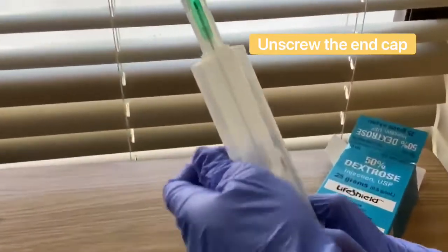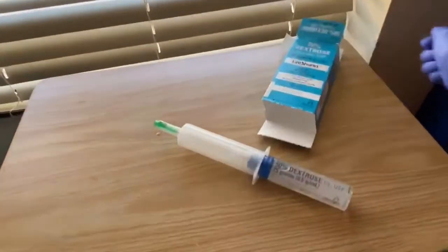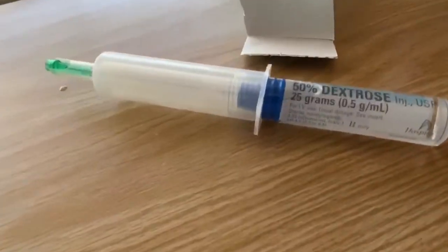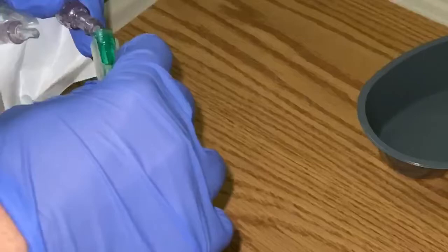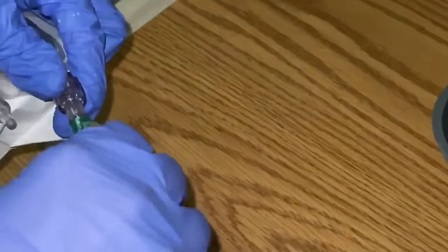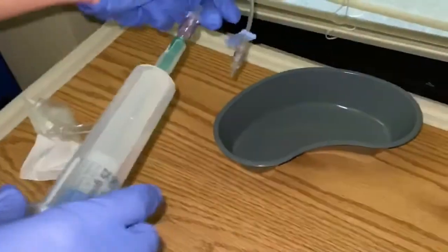You're going to uncap that end, and then you're going to push it slightly, kind of like a regular syringe. But of course it's a little bit thicker. So you're going to prime it with a little bit more force, but not excessive force. Over here I'm just showing you this because normally this is connected to a patient.